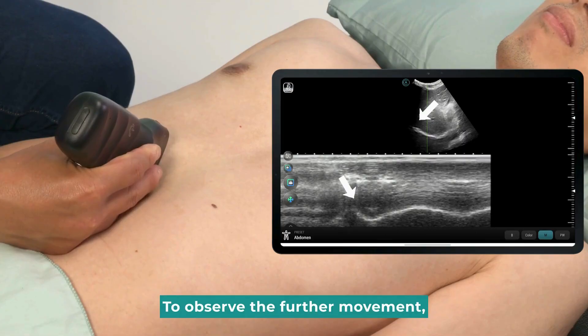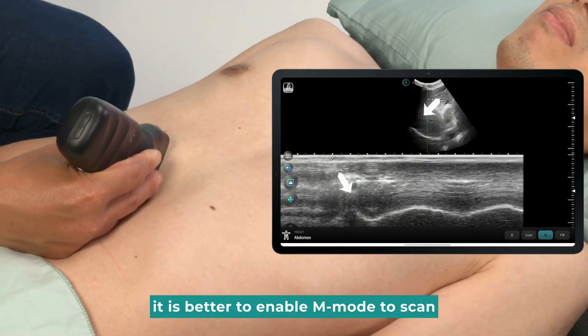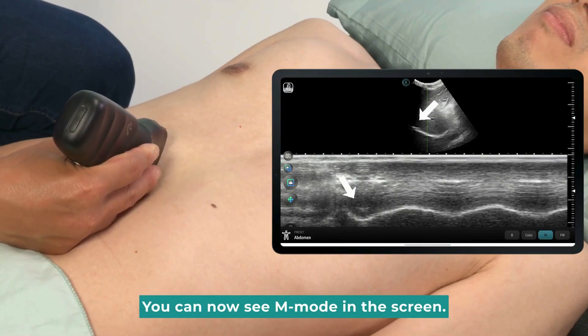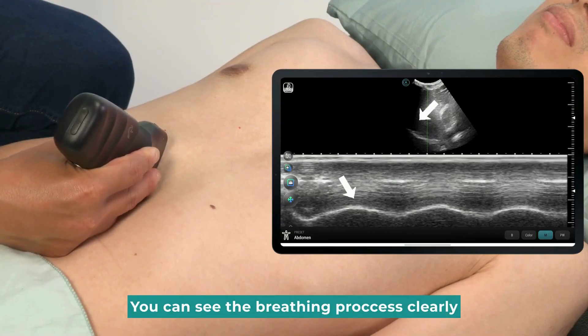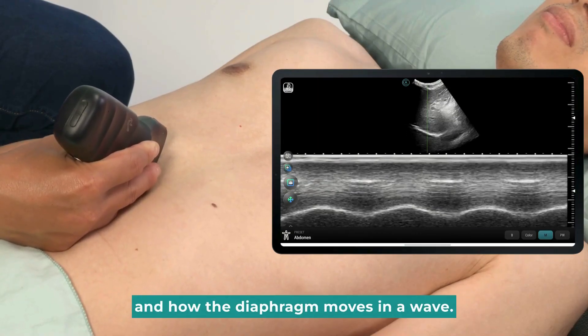To observe the further movement, it is better to enable M mode to scan. You can now see M mode on the screen. You can see the breathing process clearly, and how the diaphragm moves in a wave.